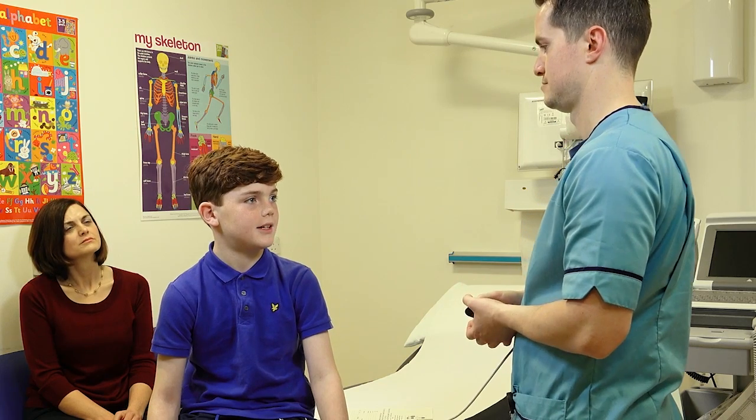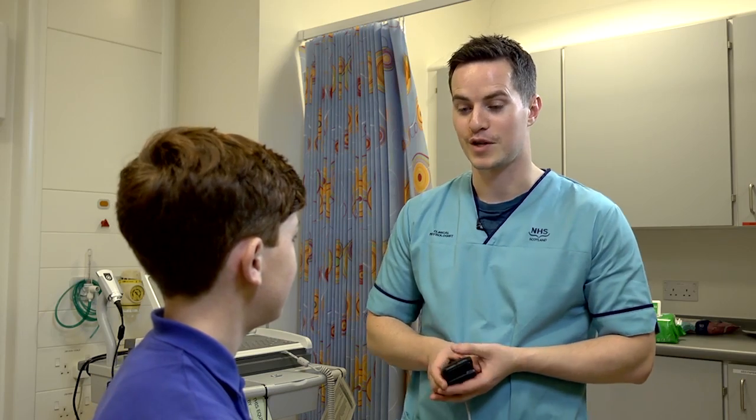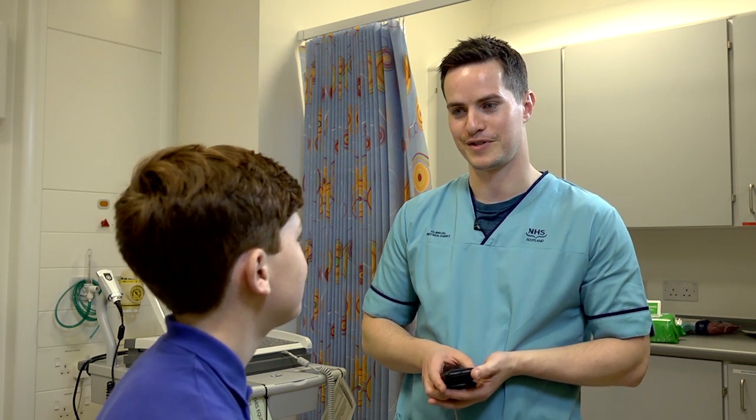So what do I do when I need to shower or bath? Unfortunately that's the only thing you can't do while wearing this monitor. For the next 24 hours there will be no shower or bath for you.